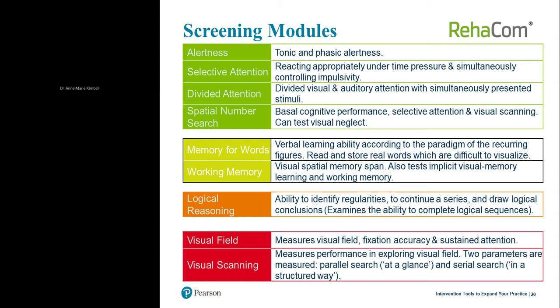And as I mentioned, RehaCom has these 9 screenings. You can see them here. I'm sorry that I put that in white font. That makes that a little harder to read.